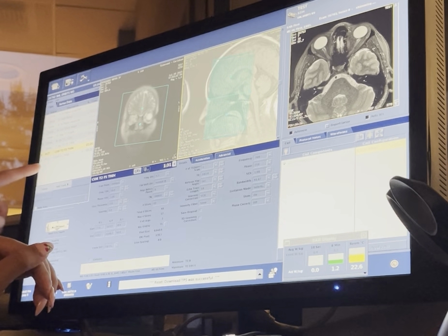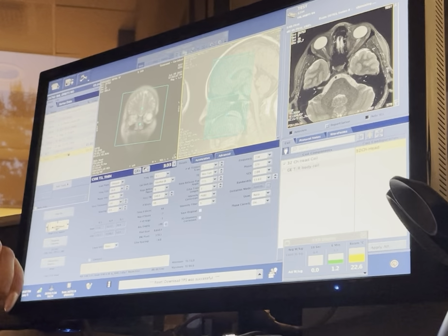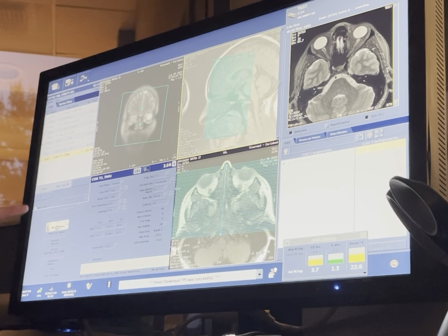Alright. This one's linked, so it's going to be the same. Let's double click on that one and lower the next, because 3.5 is long. We could do 0.5 since it's the last one and we're not going to use it for anything. Alright, now save it. But why don't you unclick auto scan?